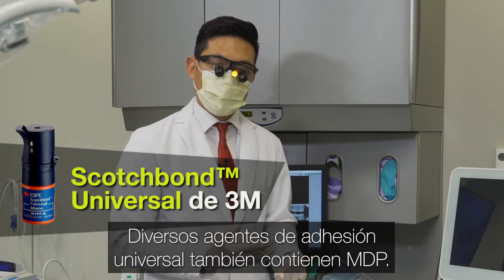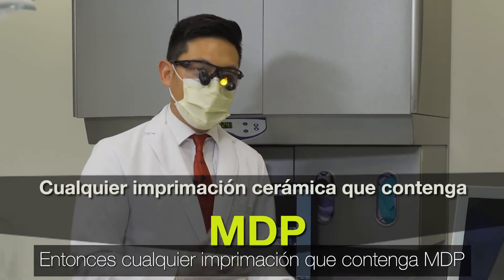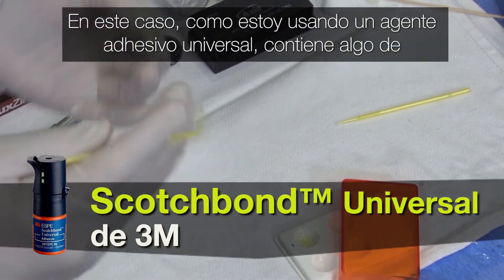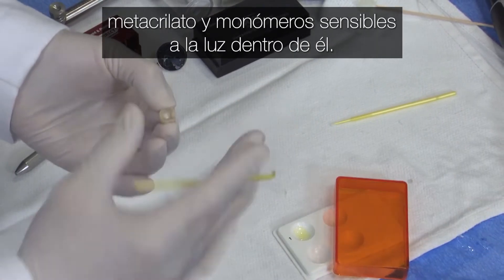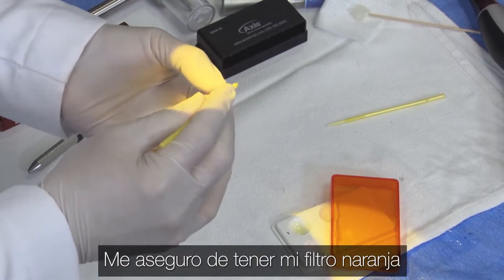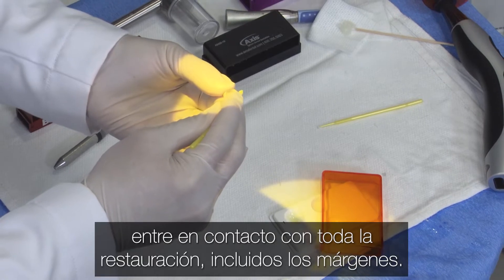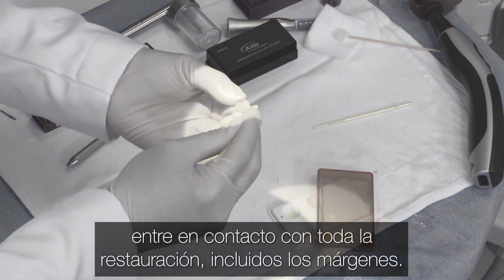Several of the universal bonding agents also contain MDP, which is the key whenever you're bonding zirconia. Because I'm using a universal bonding agent, it also contains some methacrylate and light-sensitive monomers, so I make sure that I have my orange filter on. Here I apply it to the entire intaglio surface, because we certainly want that MDP primer to come into contact with the entire restoration, including the margins.